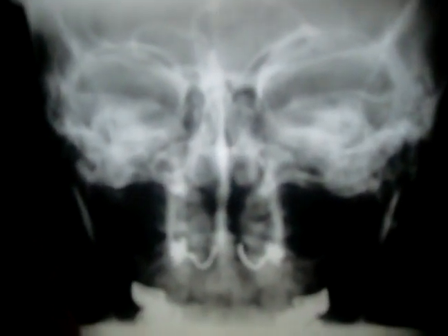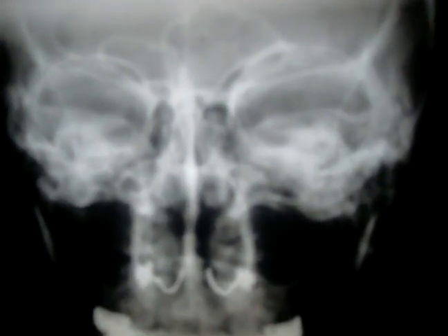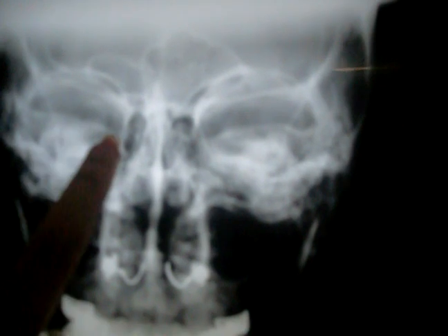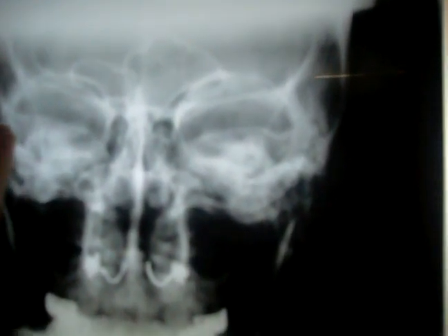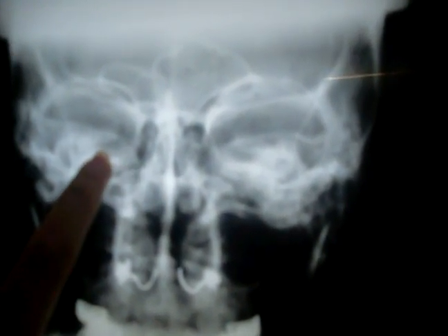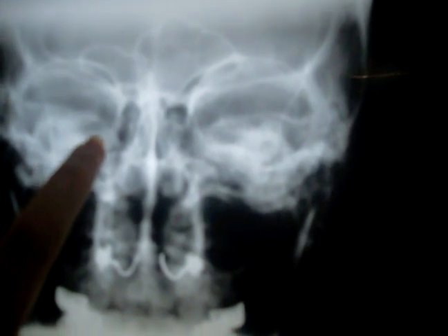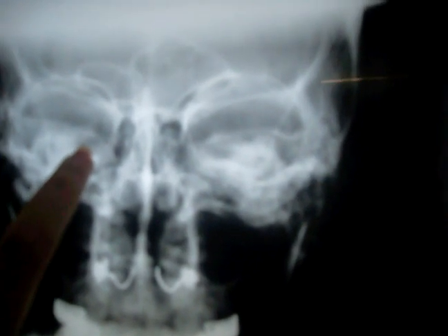This is the transorbital view. Here we mostly do it to see the petrous part of the temporal bone and the labyrinth and the semicircular canals. This is the pyramid of the petrous bone. This is the base. This is the apex between the two lips. This lip and this lip is the internal acoustic meatus.